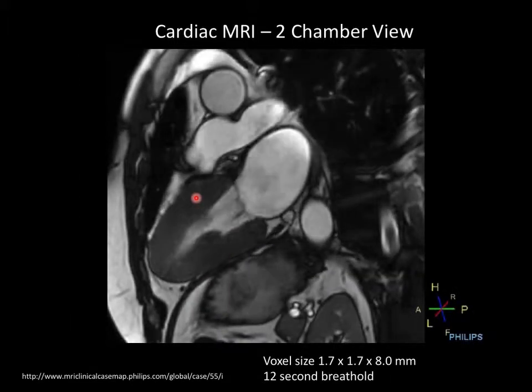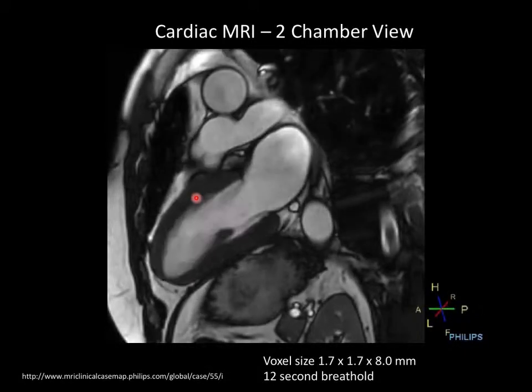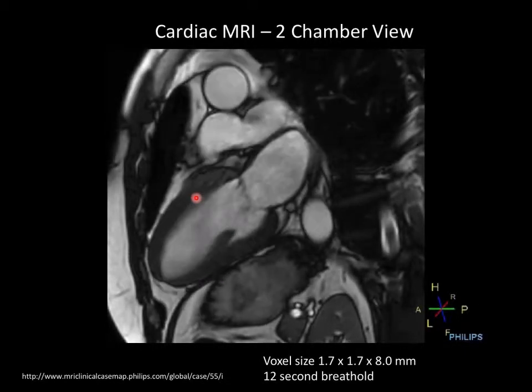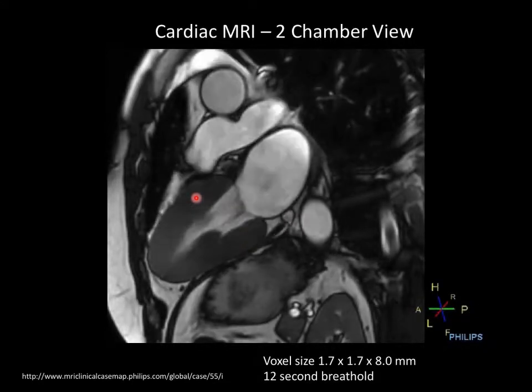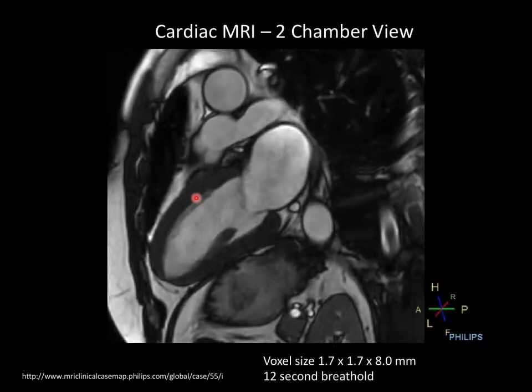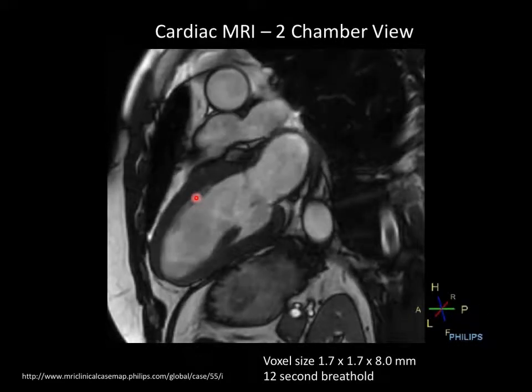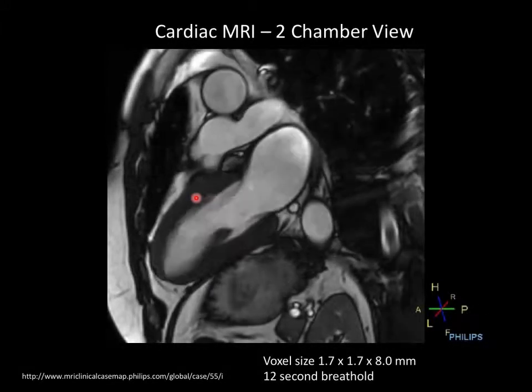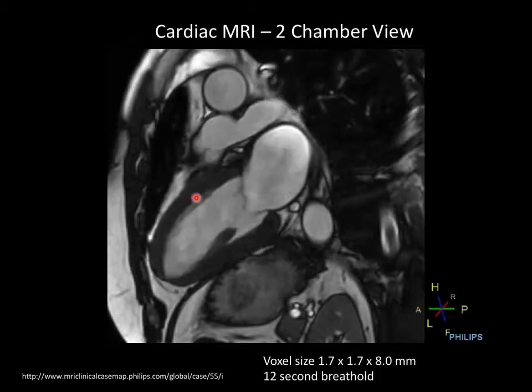And in another view, again, with MR, you have this fantastic ability to measure an arbitrary plane. You can just select any plane you want ahead of time. Unlike CT, where you acquire the whole volume and then you cut the planes up afterwards, in MR, most of the time to get dynamic data like this, you need to identify which plane you're going to look at and prescribe that on the scanner and then take the acquisition and then look at that single plane. That's definitely what was done here.